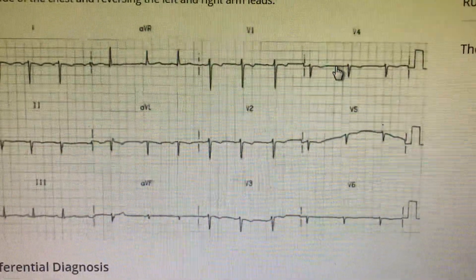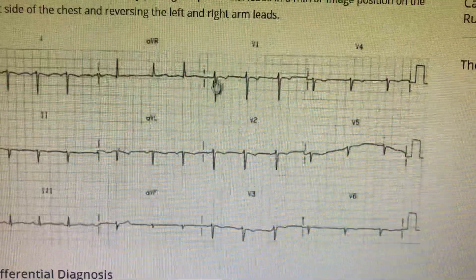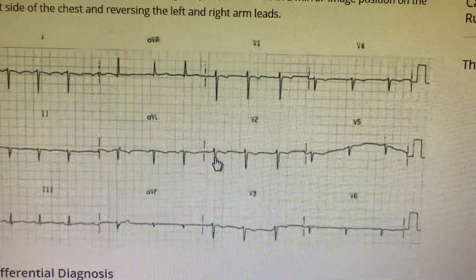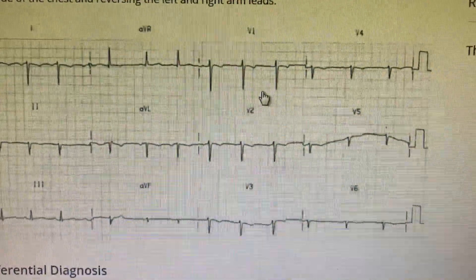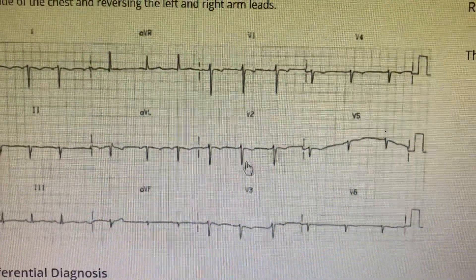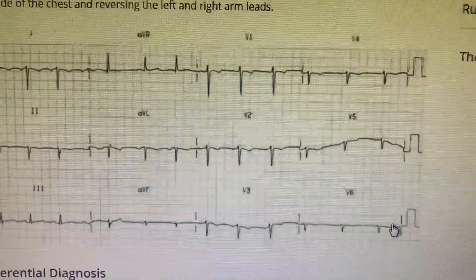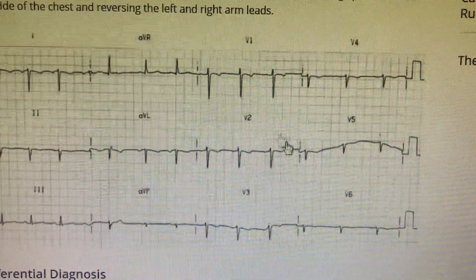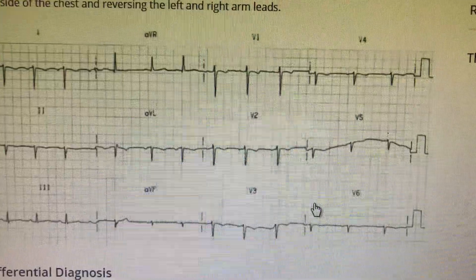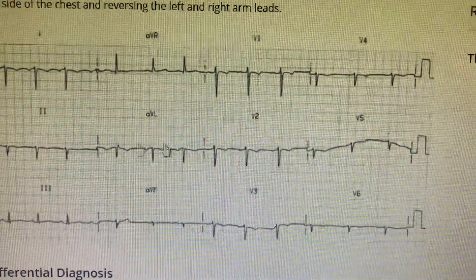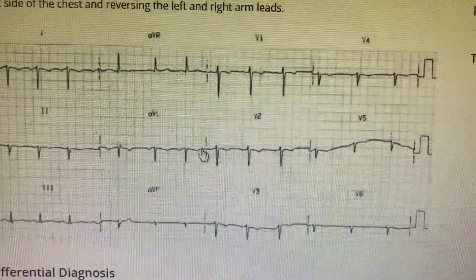Here you look at the actual precordial leads. In the precordial leads, V1 has a good R wave and a deep S. But as you go from V2, V3, V4, V5, V6, further and further, the progression of the R wave is not there. What should immediately come to mind is that the patient is most probably having dextrocardia — the heart is on the right side of the chest.